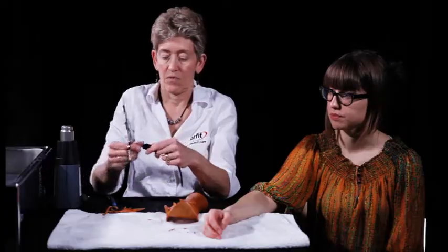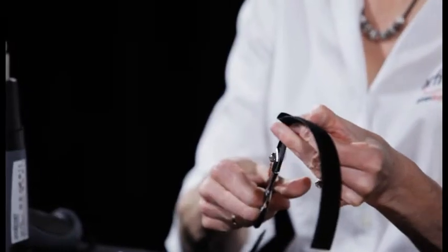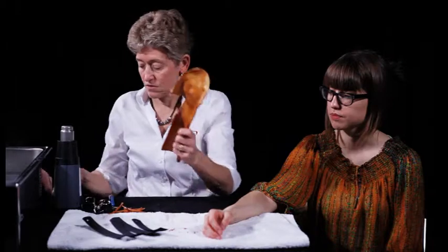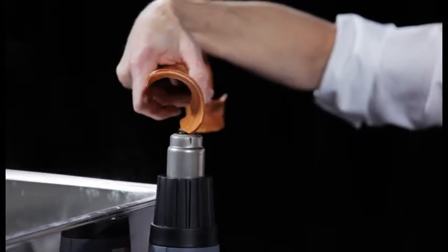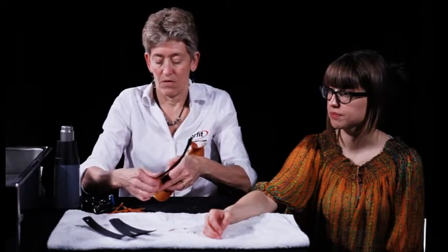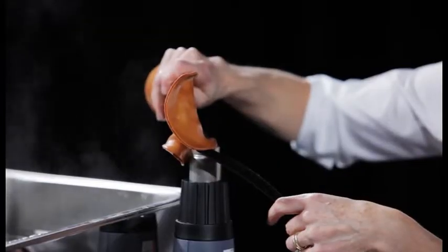Prepare the Velcro loop straps. Heat each spot with a heat gun briefly. Make sure not to overheat the material as it will lose its shape. Firmly press the Velcro loop strap into the heated thermoplastic. Repeat for the additional straps.